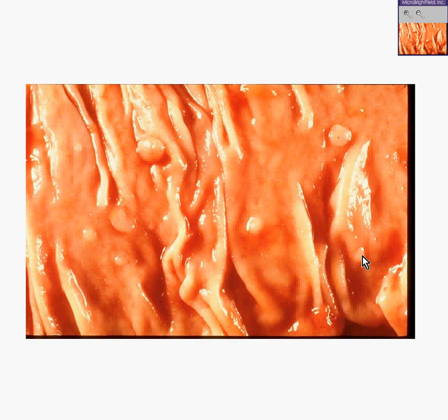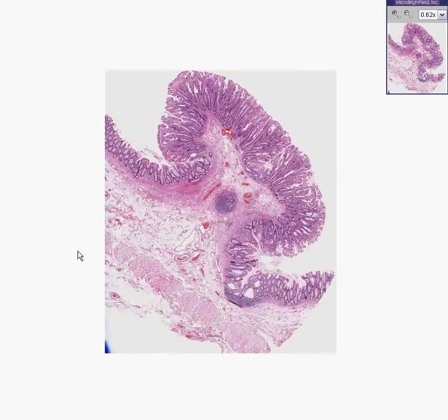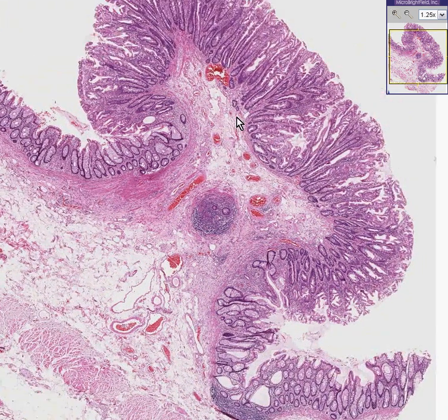Whenever you see what looks like perhaps normal mucosa, but it looks like a berry or a polyp that you could pick, this would inherit the name polyp. These are colon polyps. There are two kinds of colon polyps. There are the ones that are completely benign and never turn into cancer, called hyperplastic polyps. And then there are the kind called adenomatous polyps, which sometimes do turn into cancer, especially if they are long-standing. But many of the adenomatous never do.